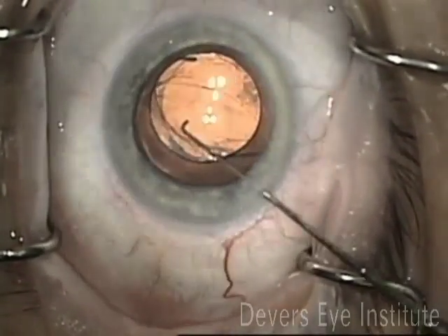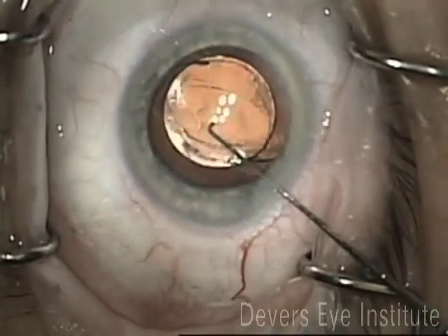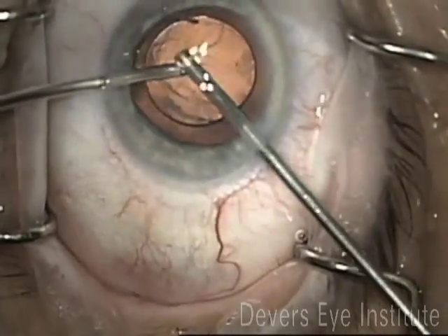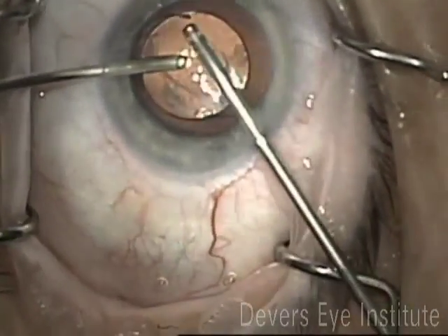Next, I recentered the intraocular lens and then used an optic capture technique where I left the haptics in the sulcus and captured the optic in the rhexis. This will allow this lens to center nicely even with the bent haptic.